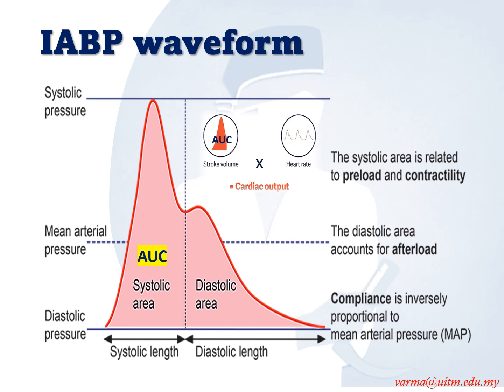As we already mentioned, cardiac output is equivalent to stroke volume times heart rate, and the stroke volume is the area under the curve of the systolic component. So the systolic area under the curve times the heart rate will give us the cardiac output, whereas the area under the curve of systolic area plus diastolic area corresponds to mean arterial pressure.